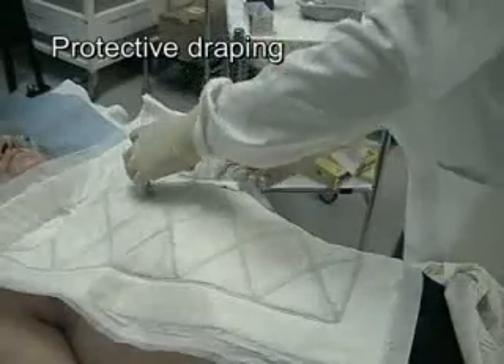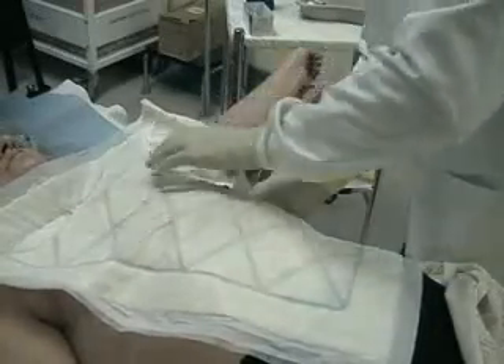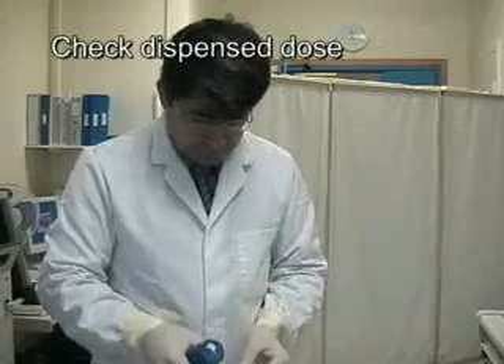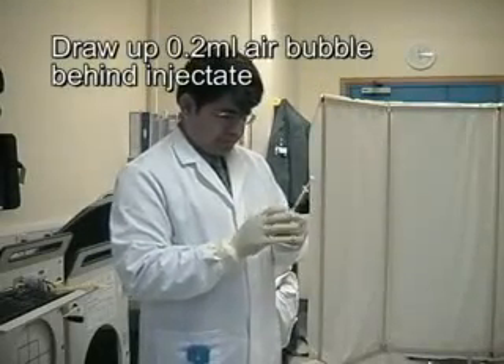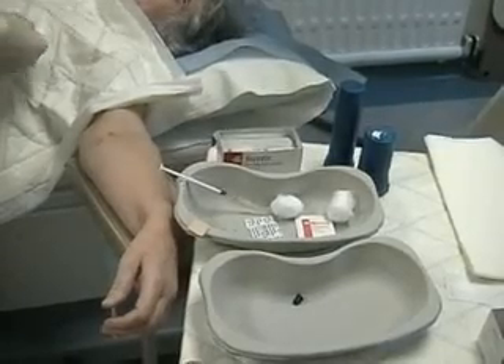Protective draping using an Incopad as demonstrated is good clinical practice. Patient identification details and the dosage of the radiocolloids are checked. An air bubble behind the injectate will ensure that the entire dose is delivered. Ensure that everything required is ready prior to injection.